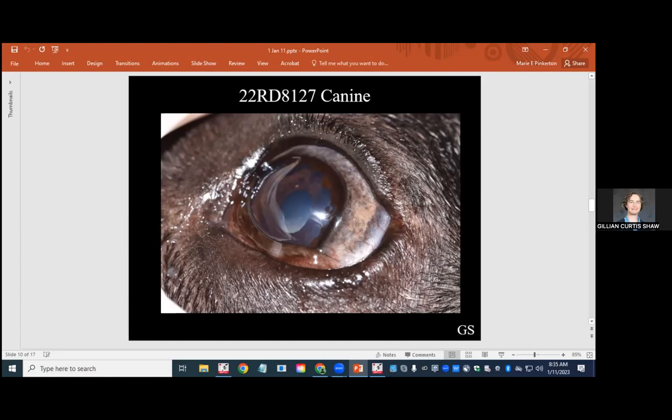This dog did have a superficial corneal ulcer, which was healed. There's some superficial corneal pigment, episcleral pigment, vitreal degeneration in the left eye. They submitted eyelids with pigmented conjunctiva, third eyelid with pigmented conjunctiva, and two samples in a cassette that are conjunctival/subconjunctival tissue that was freckled with pigment. So they say, please evaluate the additional tissue with pigment for neoplasia. I was unable to remove all of the freckled tissue in the orbit. Thoracic radiographs were normal in December of 2022, and so no evidence of metastasis. And the last juicy bit of information I'll save till the end.